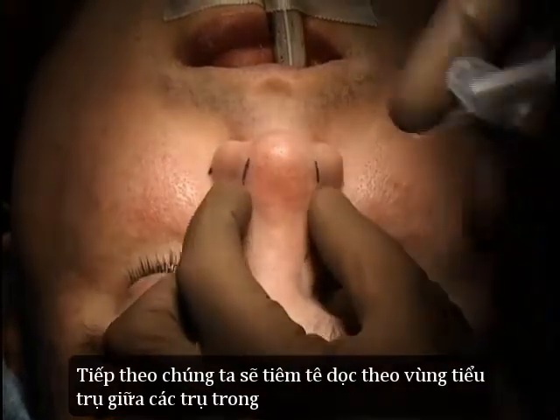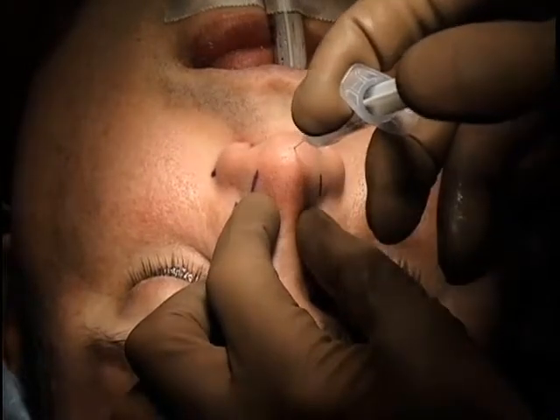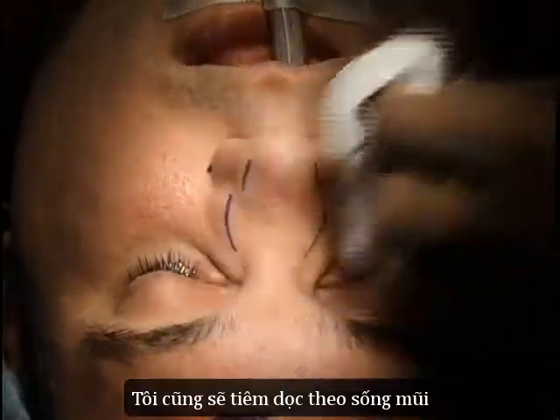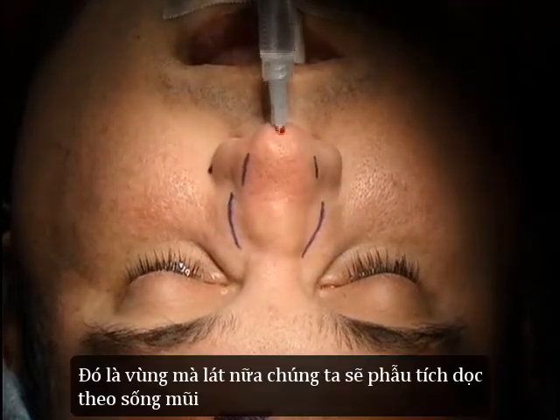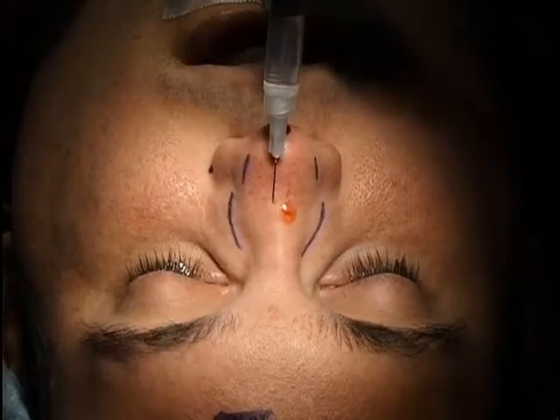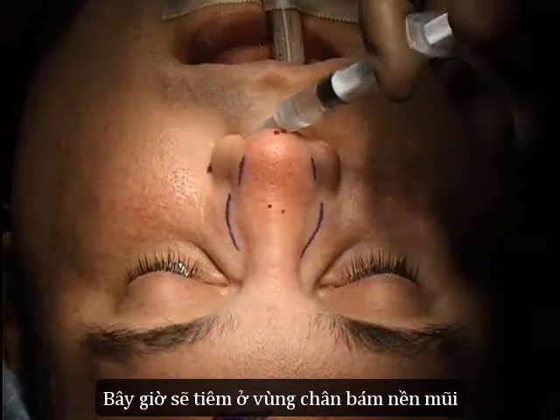Next injection we'll place is right down the region of the columella between the medial crura. And then we'll also place an injection up along the dorsum of the nose in the area that we'll do our dorsal dissection. And then we'll place an injection along the base.